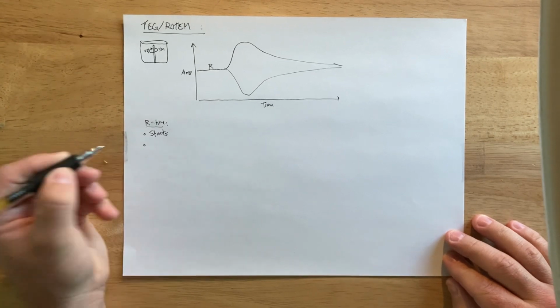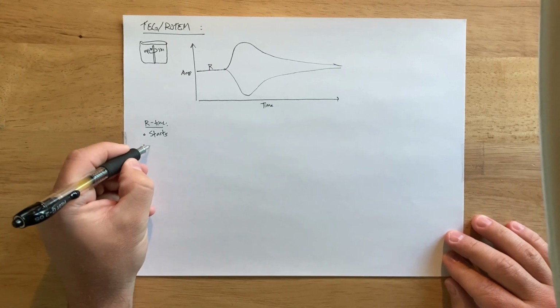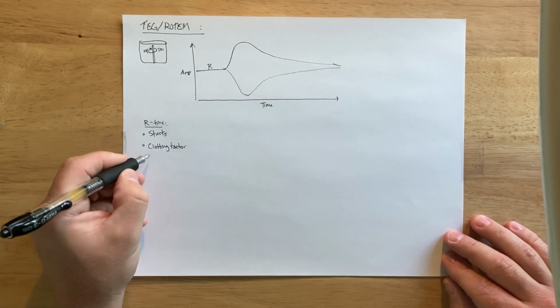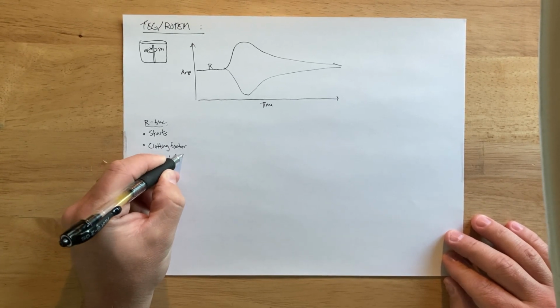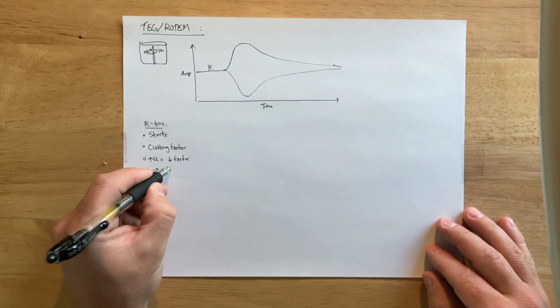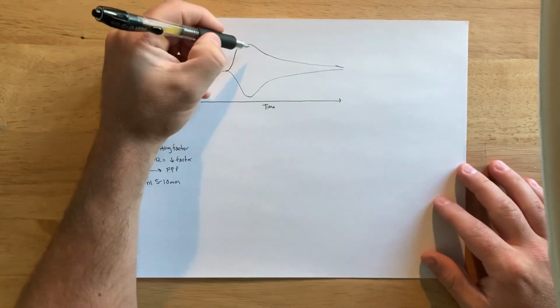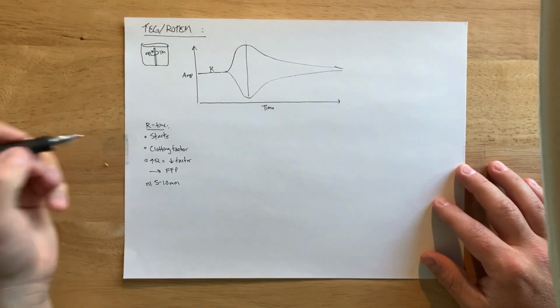All right, what is the primary coagulation factor here? It is clotting factors. If this time is delayed or prolonged, that means that you have deficient clotting factors, so you have low clotting factors. And so what you need to do is give the patient FFP. And the normal time for this is approximately 5 to 10 minutes.